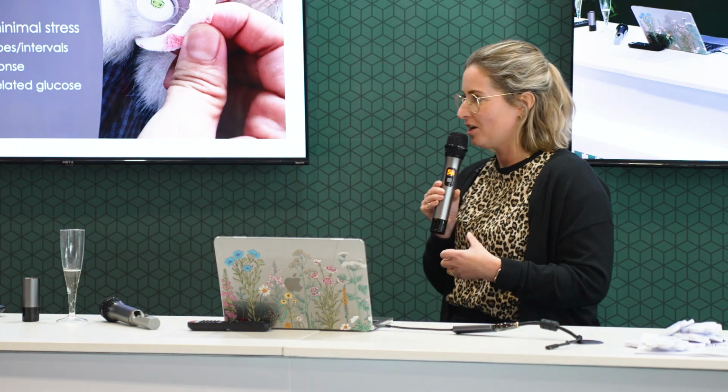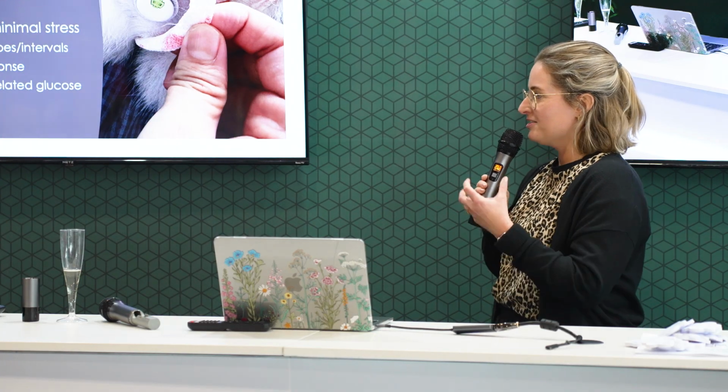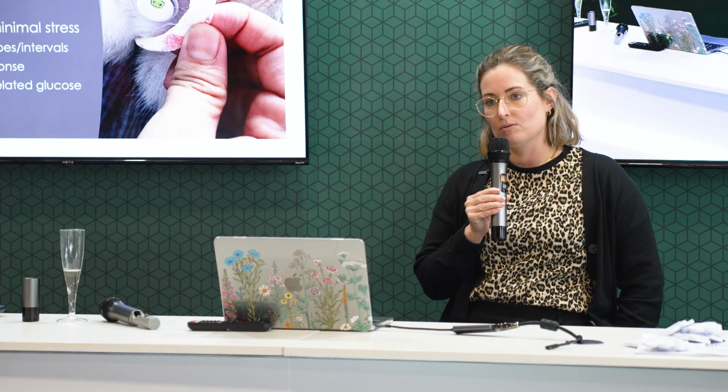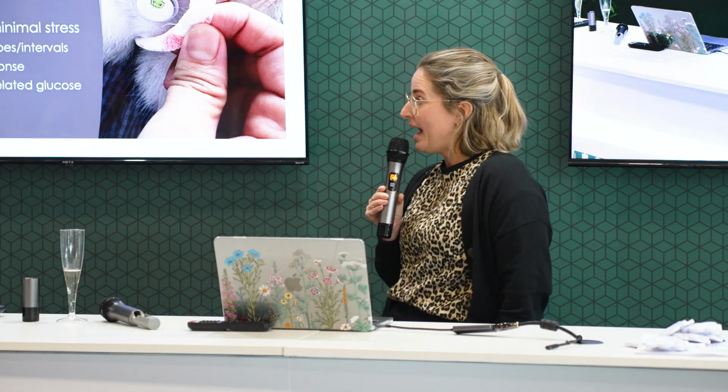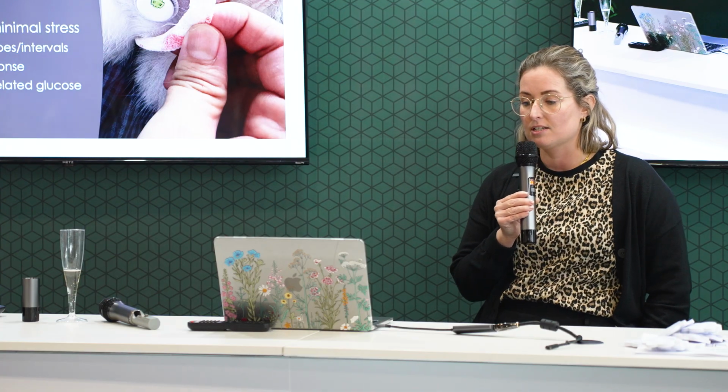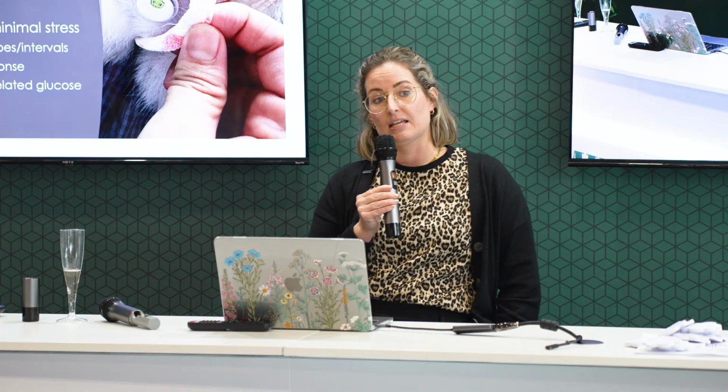Now, in terms of your outpatient application, it will be once you've got that patient hopefully over their diabetic event in the hospital, we're going to get them to a point where they're going home. And as we've said, this is all about minimal stress. It's going to help you as a vet to fine tune your treatment plan with that patient back in their home environment. As we said, adding in these other lifestyle things that are happening, such as exercise, such as diet, and looking at how those things are affecting that patient, because obviously all of our patients are slightly different.